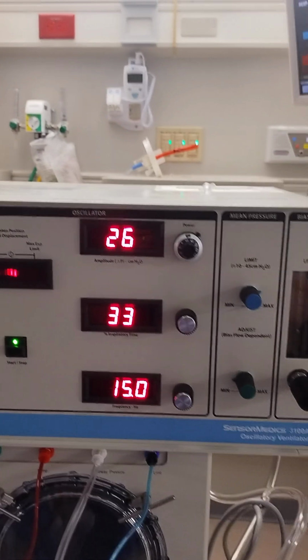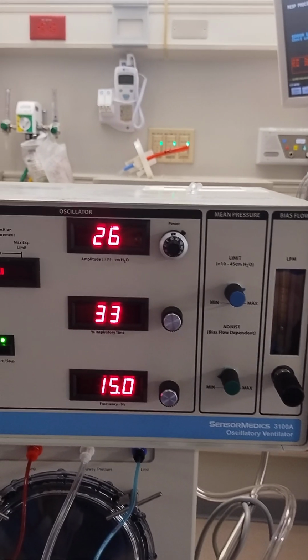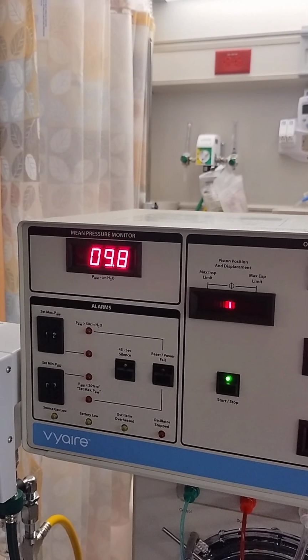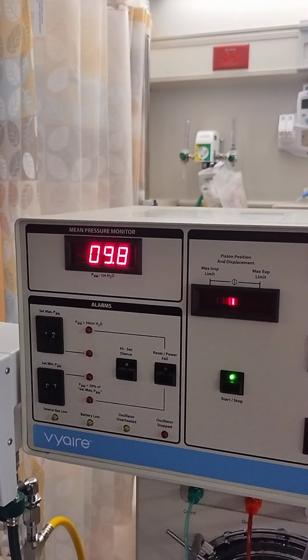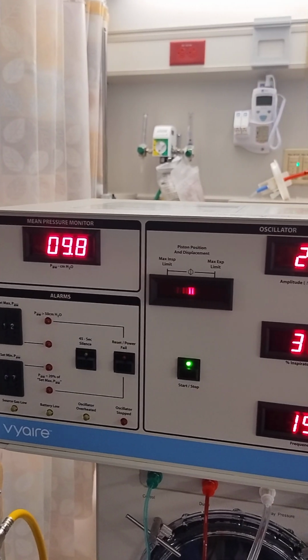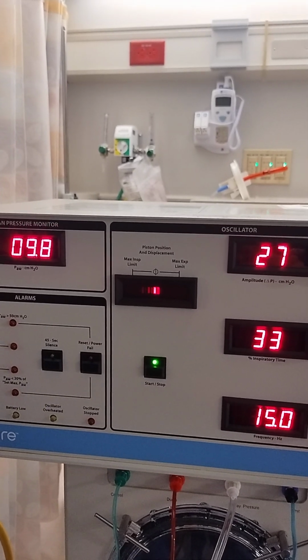You want to be cautious as far as disconnecting the circuit, because we can see that we're establishing a mean airway pressure for the baby, and if we disconnect them from the oscillator, they're going to de-recruit. So make sure that you're cognizant of that.